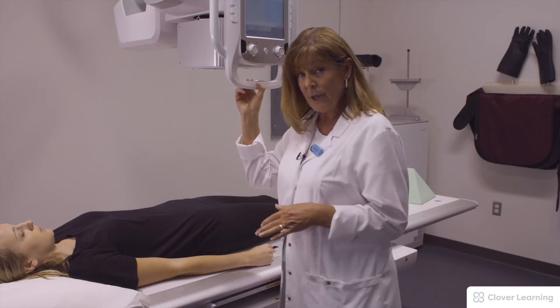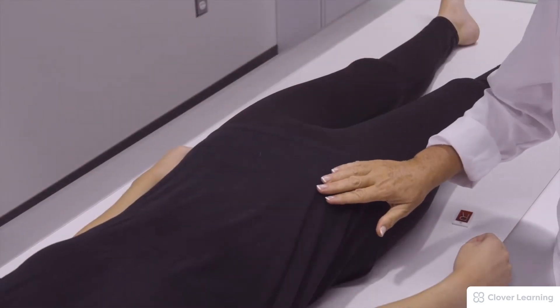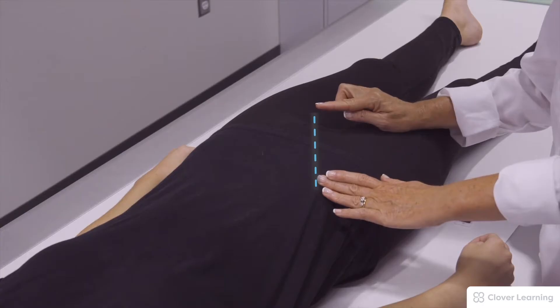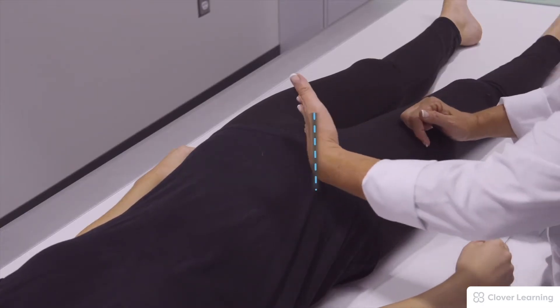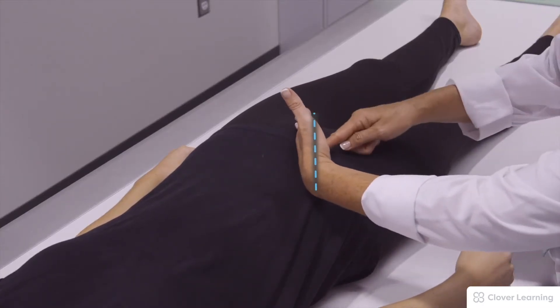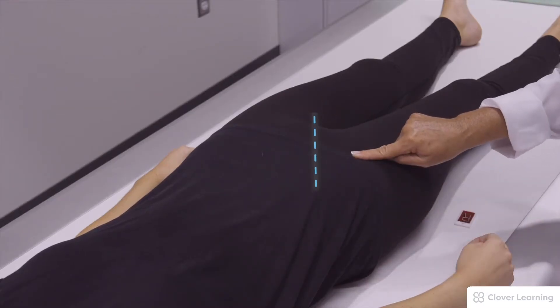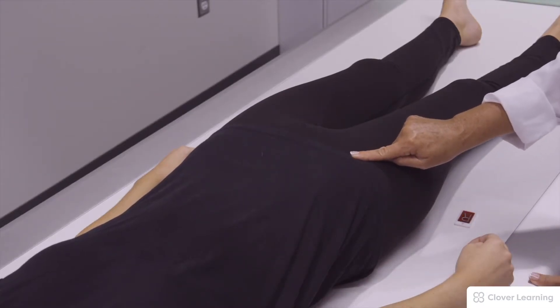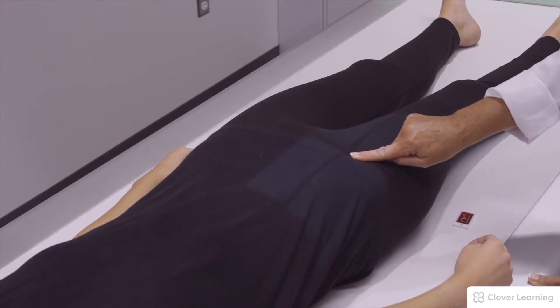For this particular view we need to create a plane from the ASIS to the pubic symphysis, and from there we're going two and a half inches down — I'm going to hold my finger right there. We're going to float the table right over that spot and then collimate.